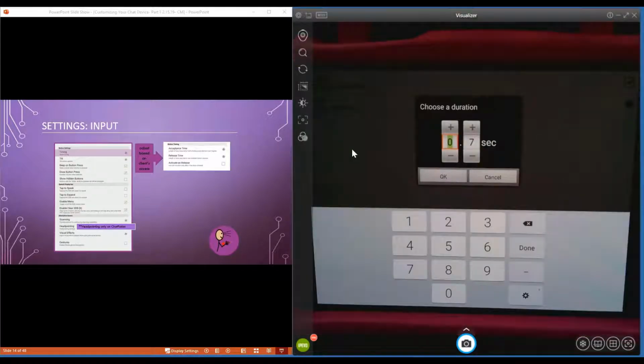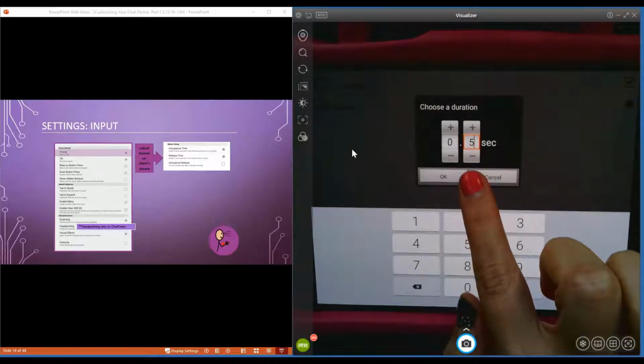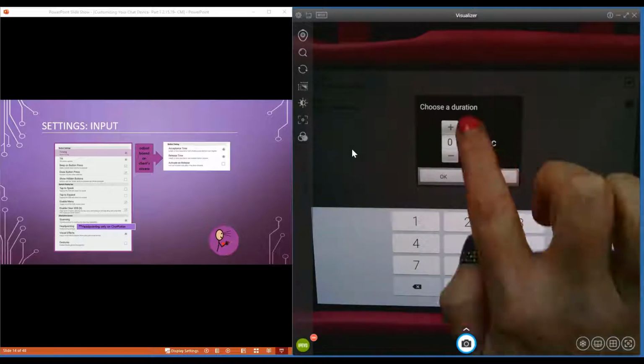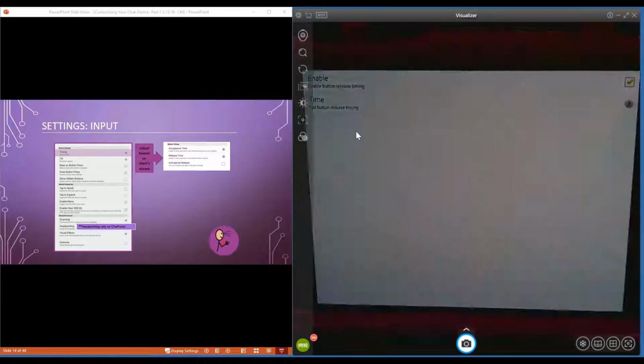Where we do have a concern about some self-stimulatory behavior, we can accept that first push. Let me just show you. You can again play with the time. I find for most of my teams that it's anywhere between half a second or 1 second, 1 full second is a good time. So I'm going to leave it at 0.7 seconds, okay? And I'll show you what this does.